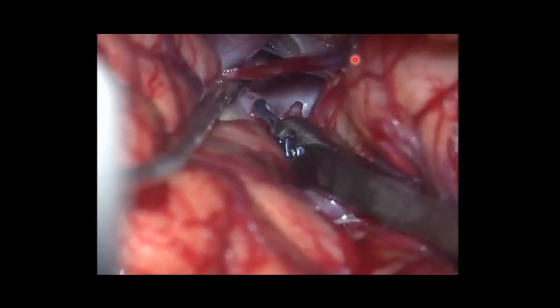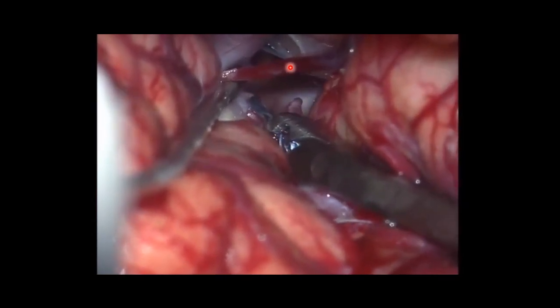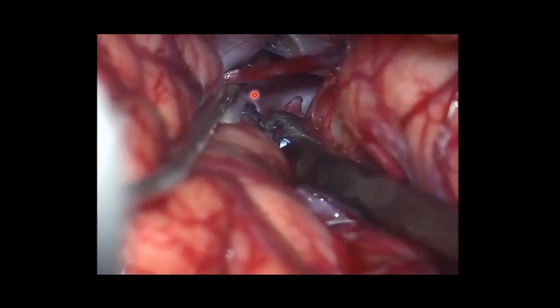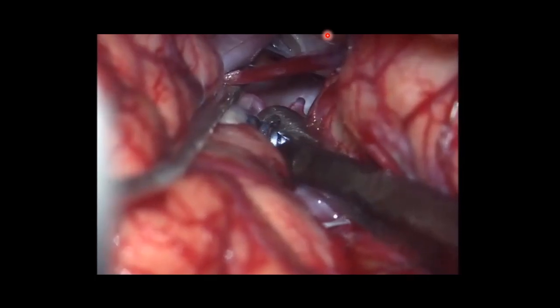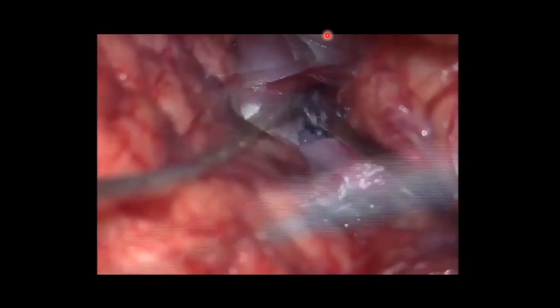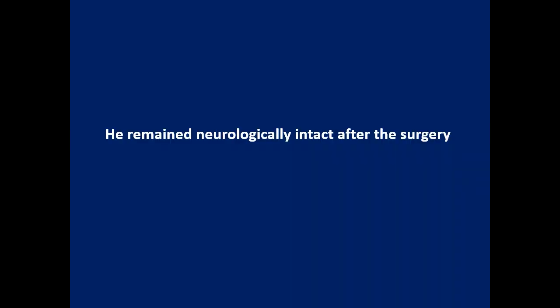He has to clip, and this is the anterior choroidal artery. So you cannot clip the anterior choroidal artery, just the aneurysm. This is kind of tricky. Very small clip. So this is the anterior choroidal artery. Trying to preserve it. Now the small aneurysm has been clipped. Now he's checking. The artery is there. It's not included in the clip. The patient remained neurologically intact after the surgery.